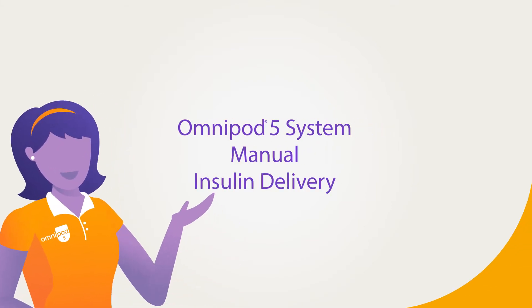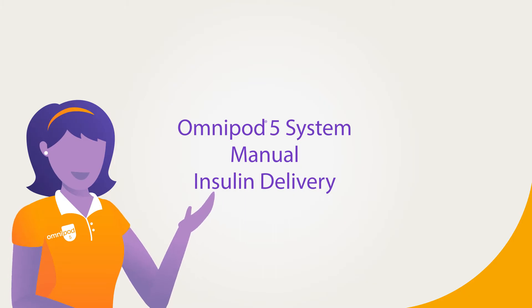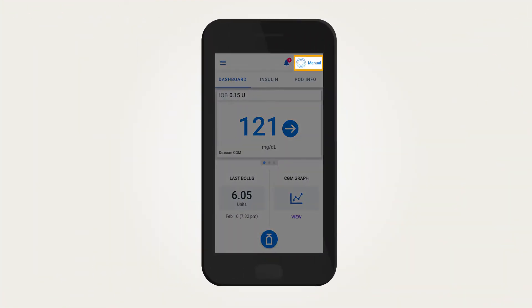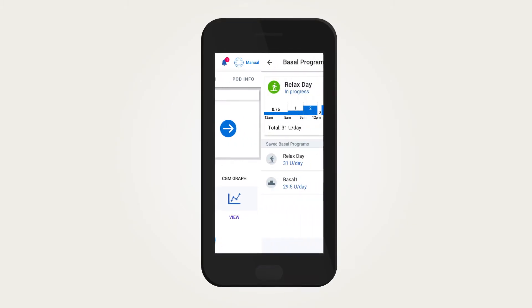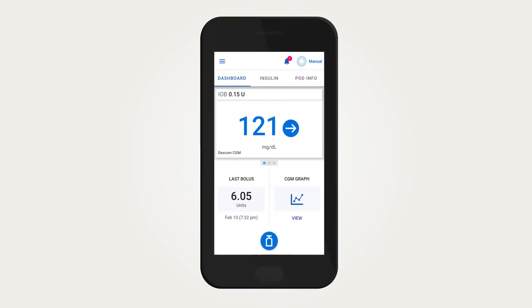Omnipod 5 System – Manual Insulin Delivery. When the Omnipod 5 System is in manual mode, basal insulin delivery is based on your entered basal program and does not change in response to CGM values. This mode is most like standard insulin pump therapy, since any changes in basal insulin delivery must be done manually.